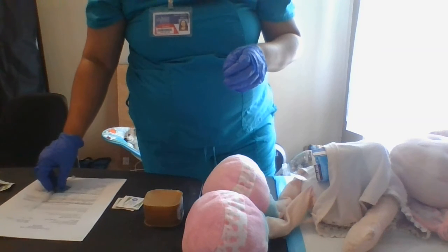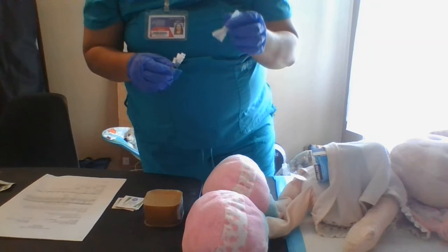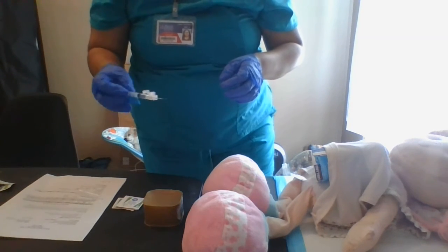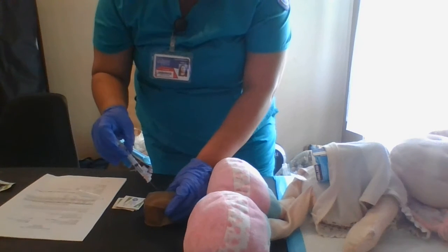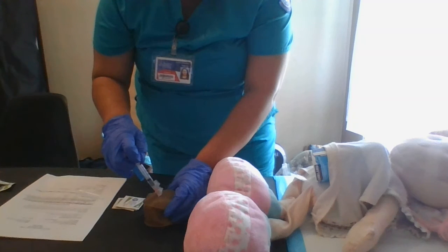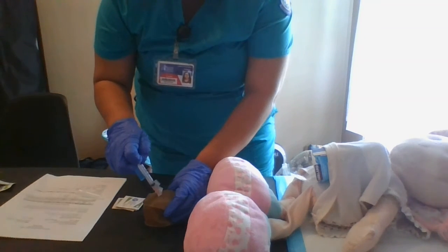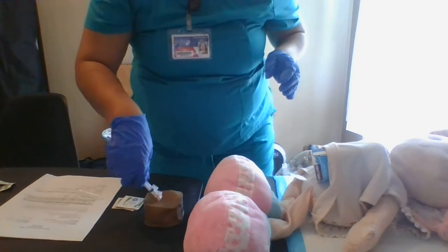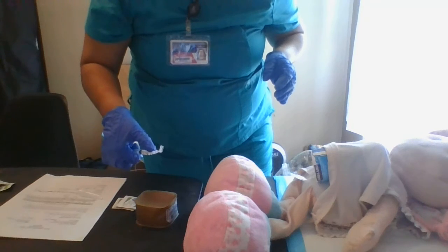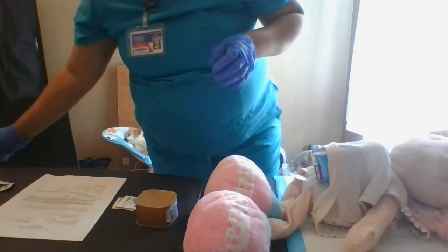It is now dry. I can proceed to give my injection. Okay, making sure my bevel is up. I'm going at a 45-degree angle. I'm administering my medication. Okay, medication administered. With one hand, I'm activating the safety. And now I'm discarding in the sharps container.